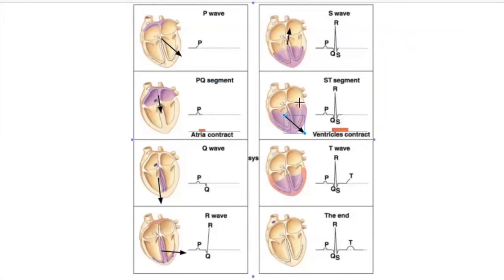And it's going to still be mostly up, right? That's mostly what's left to activate. And I'll just tell you from intuition that the left ventricle is a little bit bigger, right? And so it's going to be skewed a little bit towards the left ventricle because that's where the last little bit of tissue is to activate. Okay, so we've got these series of electrical dipoles that are representing the heart. Does that make sense? Okay.